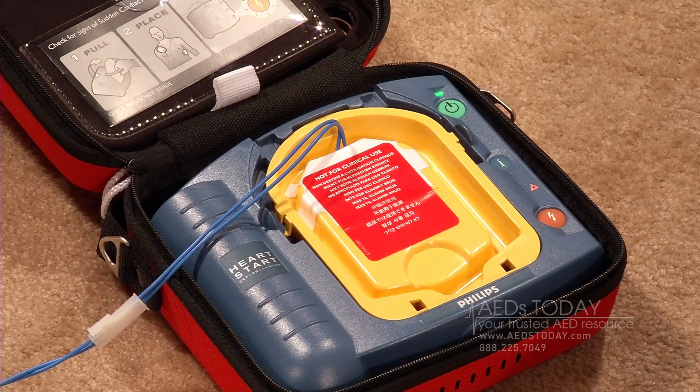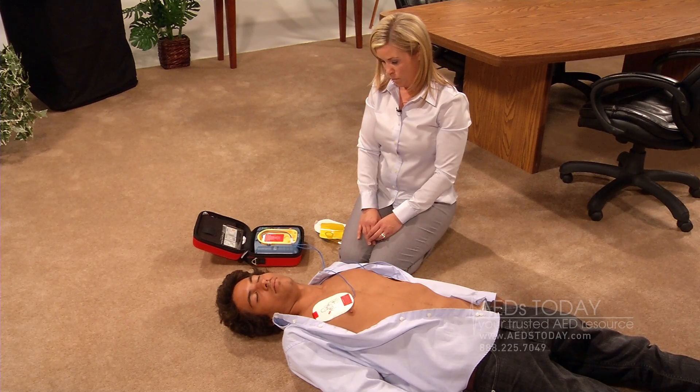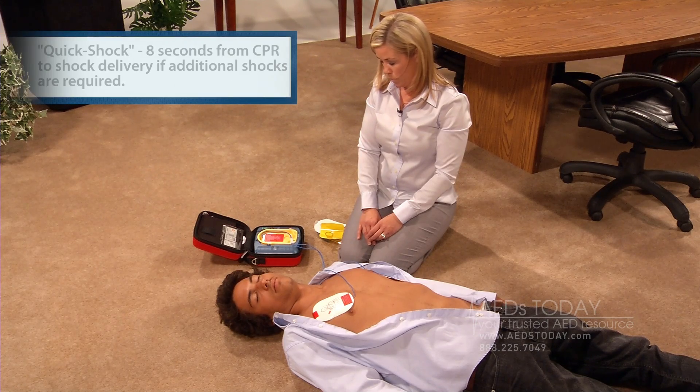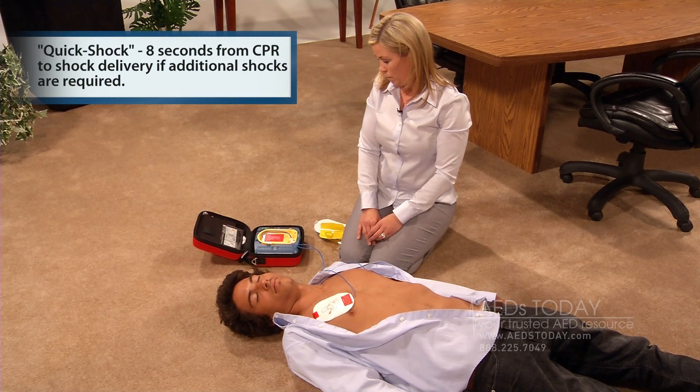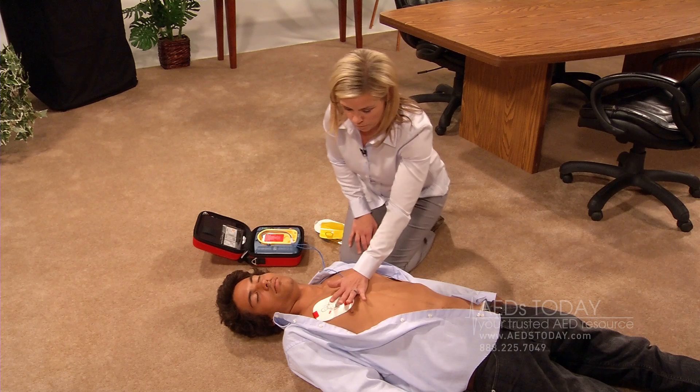Stop CPR. No one should touch the patient. Analyzing. Keep standing clear of the patient while the AED is evaluating. It may decide to shock again, or it may say: Shock not advised. It is safe to touch the patient. If needed, begin CPR.